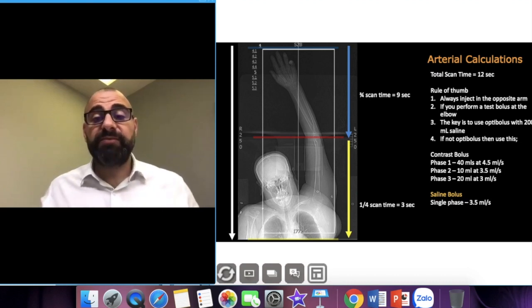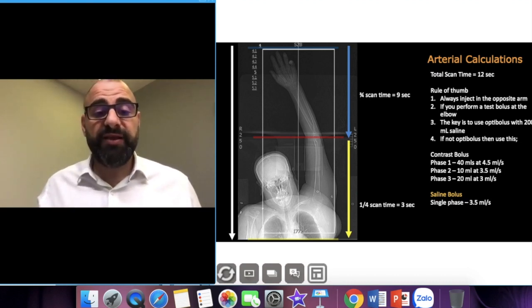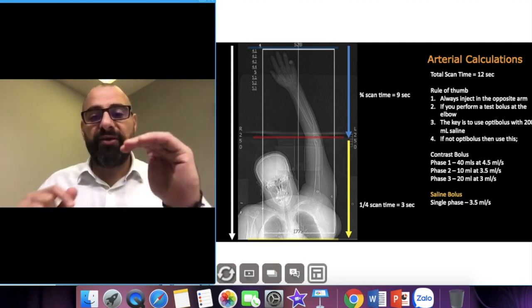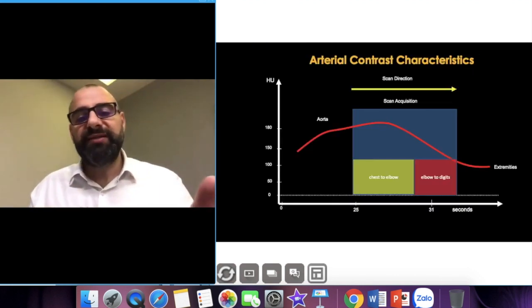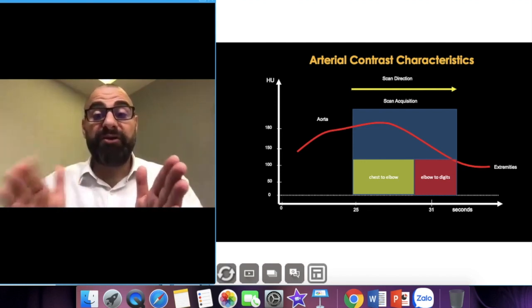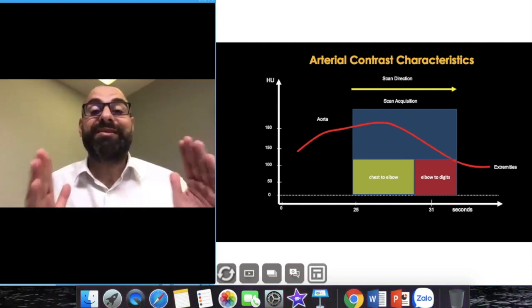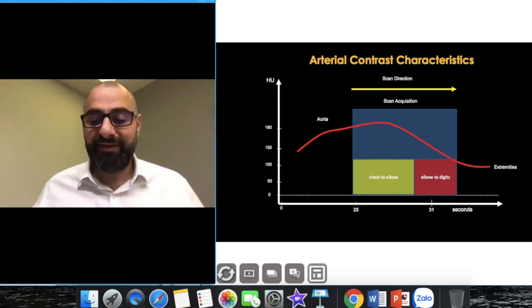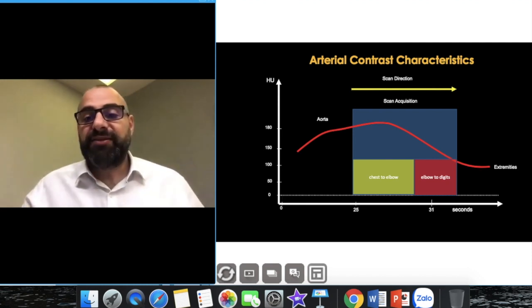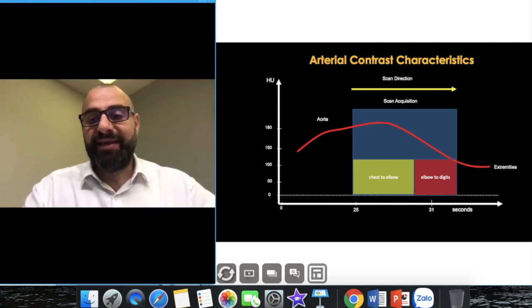Looking at contrast media flow dynamics: as contrast comes up through the aorta you always want about a two-second delay to reach the peripheries and extremities. That's why we always scan from the chest to the fingertips but monitor at the elbow — because by the time we've scanned halfway through, the contrast is right at the fingertips, giving good filling. That's something to really pay attention to.